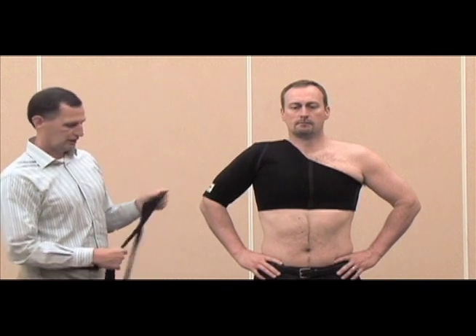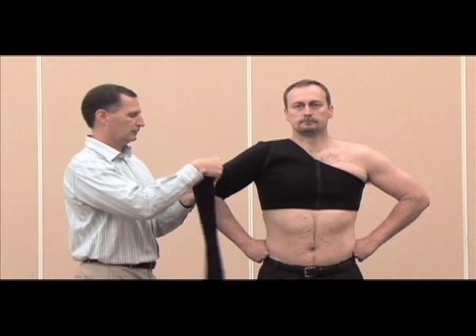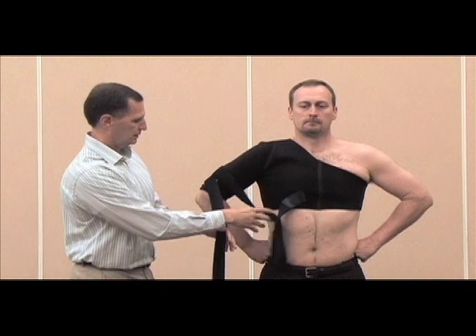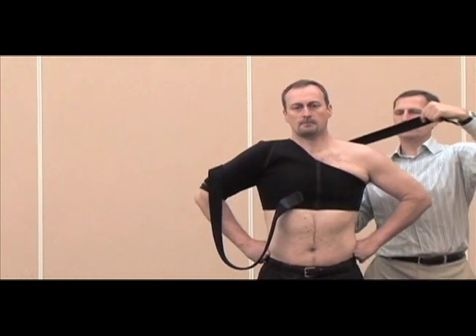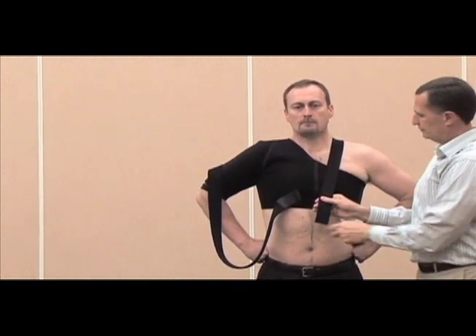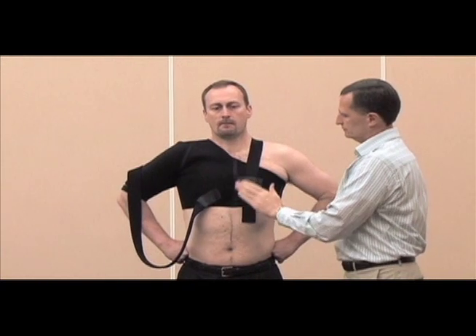The first application will be for an anterior instability. Use a bifurcated strap — it'll start underneath the arm and come forward with both straps. Take the low strap through the armpit, up over the opposite shoulder, remove the Velcro, cut it to the desired length, and Velcro it down.